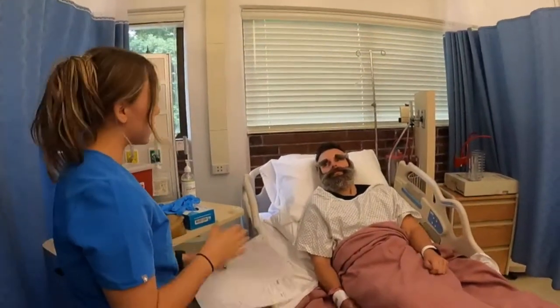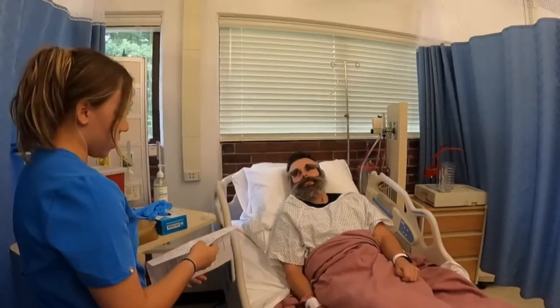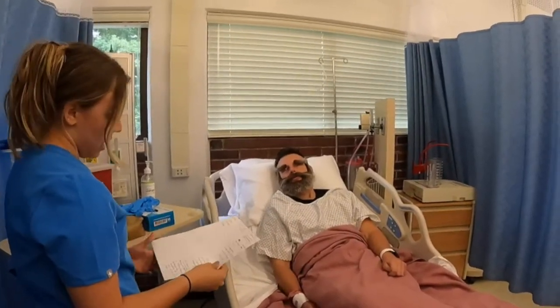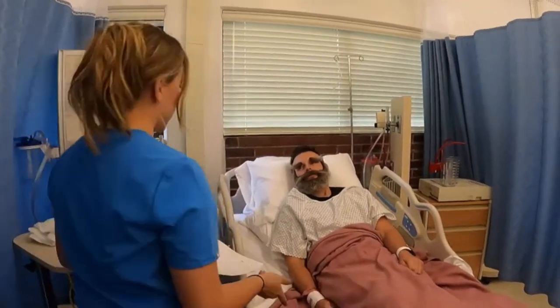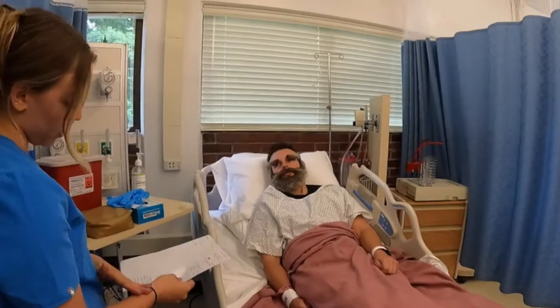Now that we have that information, we're going to tell the patient what we're administering today. Today I'm going to be administering morphine for you. It's to treat your pain and it will be an intramuscular injection. Have you ever had this medication before? No. Some signs and symptoms of morphine are lightheadedness, dizziness, drowsiness, or slower or difficulty breathing. Some education: if you're taking an opioid with a benzodiazepine, like Xanax, this can increase respiratory depression, and you don't want to drink alcohol while on this medication.